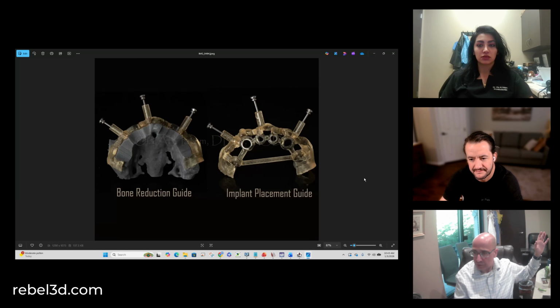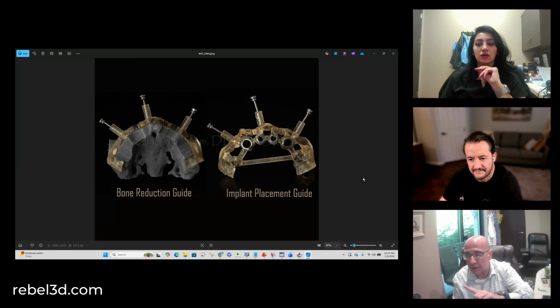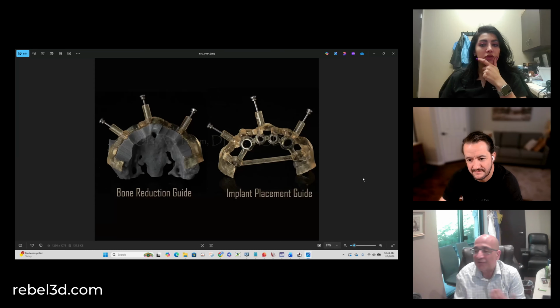Versus the other one, no. Matter of fact, I went to the surgery itself, and something didn't go well, as Dr. Ola mentioned, and we can just change it. We have one of the cases where I placed implant number 4, and it didn't go well, no way, and it's one of my main anchors. In 2 minutes, I changed location to another pterygoid implant, 26 millimeter, and I anchored the pterygoid while I'm in the surgery. Safe. We can't do this with the statics. You have this kind of flexibility. It's an all or nothing. Static guides are all or nothing. You either go according to plan.